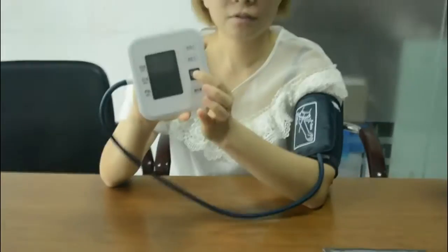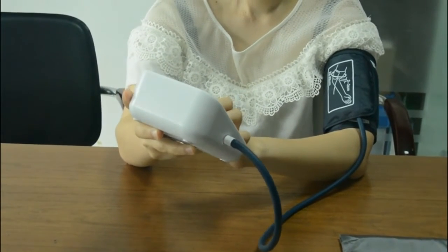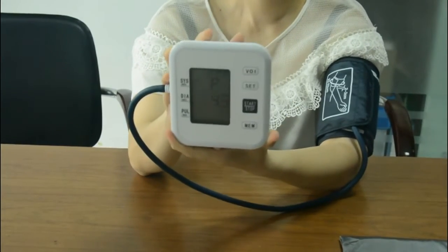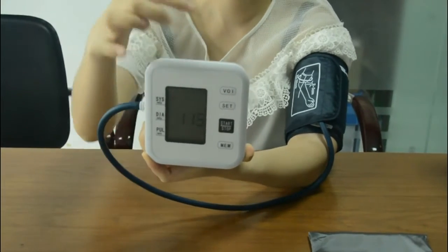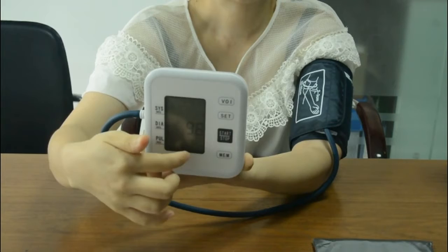Power on the device. Please remain seated and refrain from talking during measurement, and keep the cuff at heart level. The device is now testing your blood pressure and heart rate, and the result will show on the display.